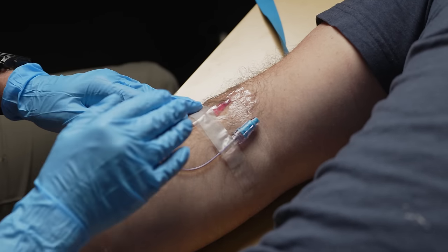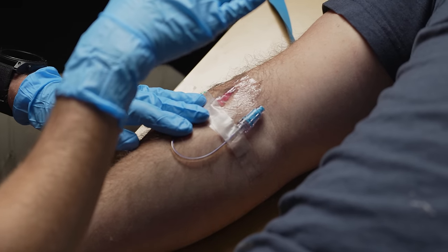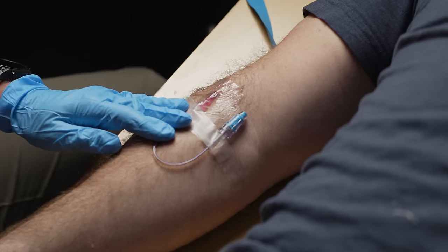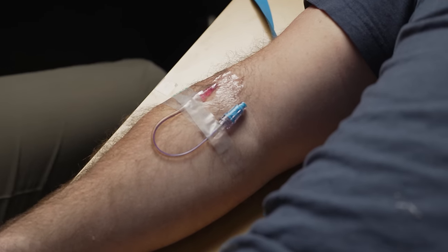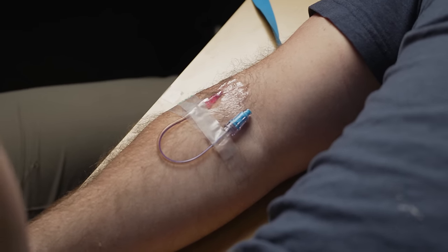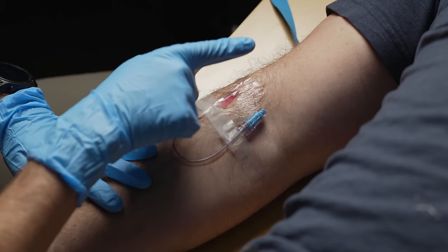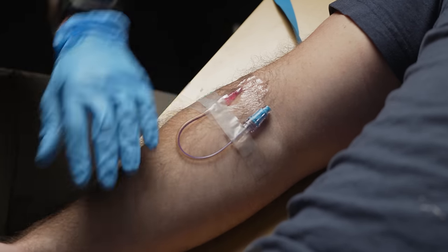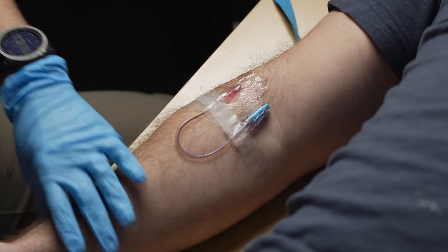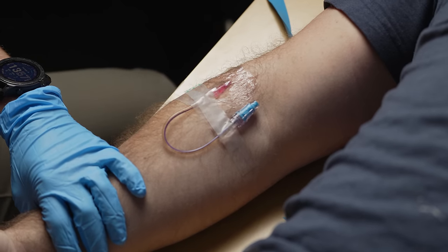When it comes to starting an IV, you're always starting the IV towards the heart. I'm always pointing this needle towards his heart — up his arm, up his leg, or if you were starting a scalp IV on a baby, down towards the heart. Same with EJs on the neck — you're going to point that down. In this case I'm pushing up; I wouldn't want to start any IVs going the other way. This IV might be kind of positional but he can bend his arm and it's not going to completely ruin it right away.